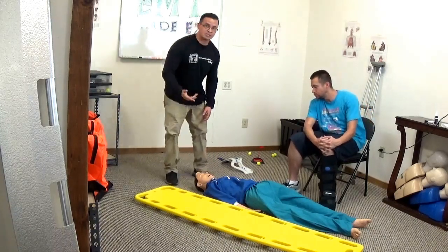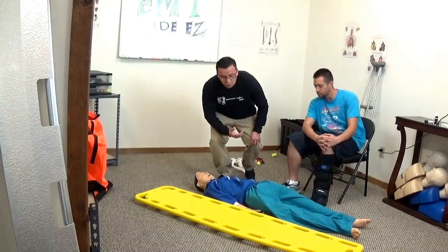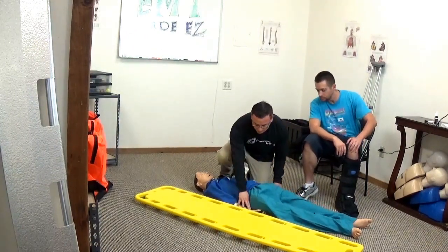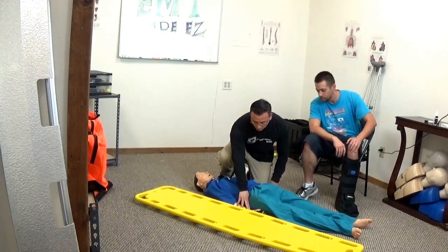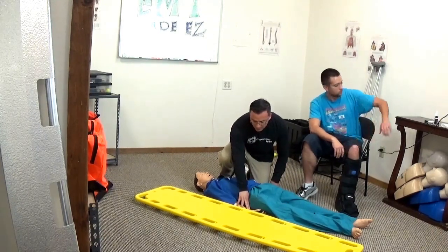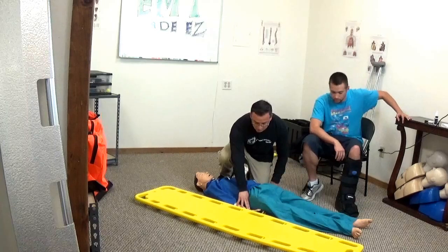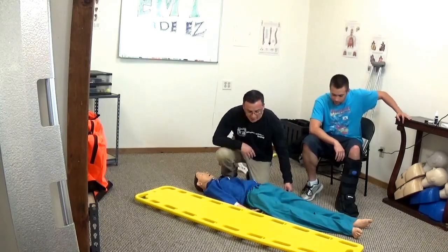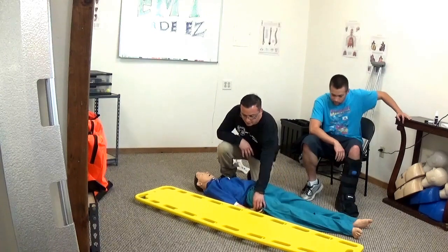After that you're going to check for CMS — circulation, motor, and sensory. Check for pulses on both radial sides and ask if pulses are present. Then tell the patient to squeeze your fingers and ask which finger it is that you are touching.